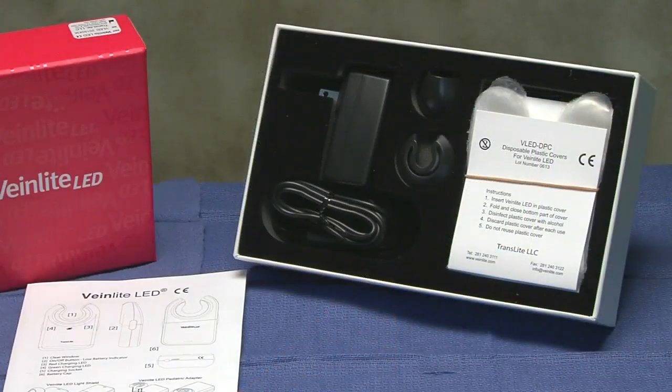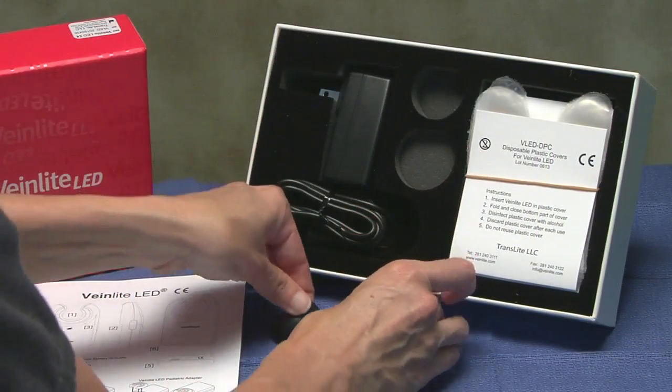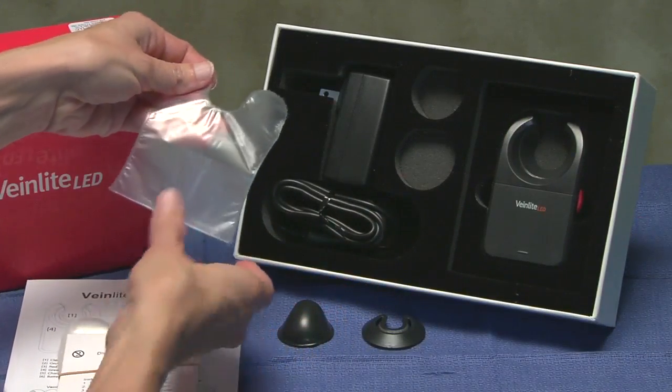In addition to your VeinLight device, your kit may contain several accessories, such as a charger, pediatric and light shield attachments, and a starter pack of disposable plastic covers.